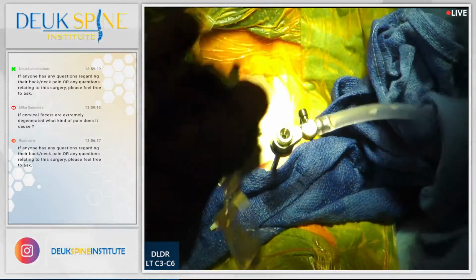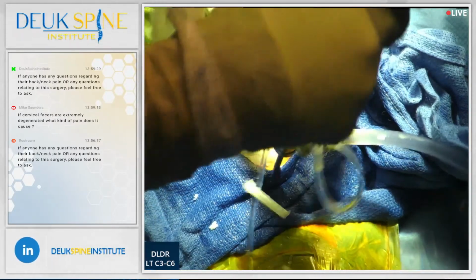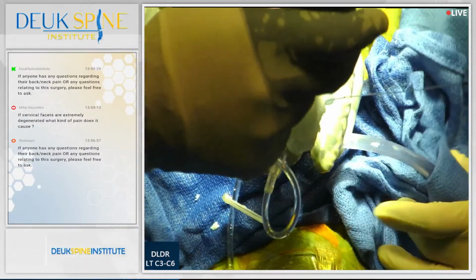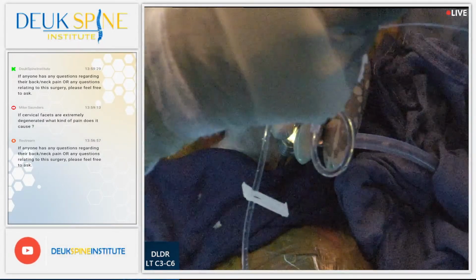Get this straight and keep it straight. Stop letting it move. We have another question, coming from Mike once more on YouTube, asking if cervical facets are extremely degenerated, what kind of pain does it cause?